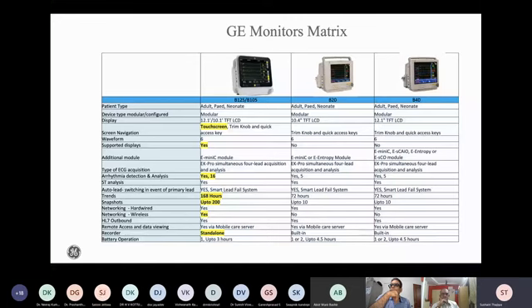Trim knob, you started with dash monitors, if somebody remembers. I remember very correctly because when I was there, we still were looking at Solar and Dash. I've recently seen a 20-year-old HP monitor, sir. So it's still there, I think, but we're moving in a direction where most of the monitors now have digital outputs, and they look at advanced parameters as well as advanced input areas.